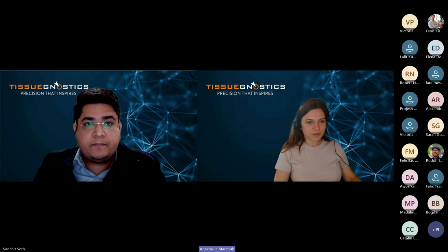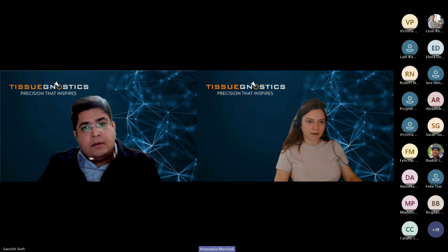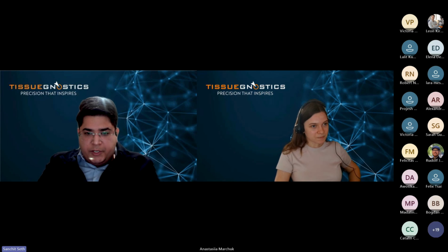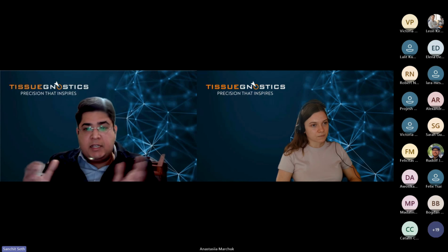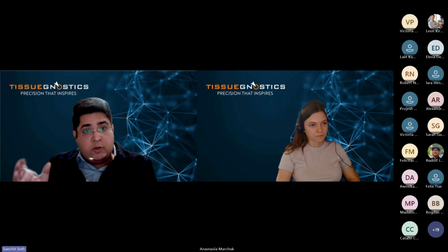So the first question would be, which sample types can I analyze in StrataQuest? That was a very good question, Anastasia. I think I have mentioned in the presentation as well that at TissueGnostics, we provide a whole solution for the scanning as well as for analysis. But our StrataQuest platform is standalone as well.